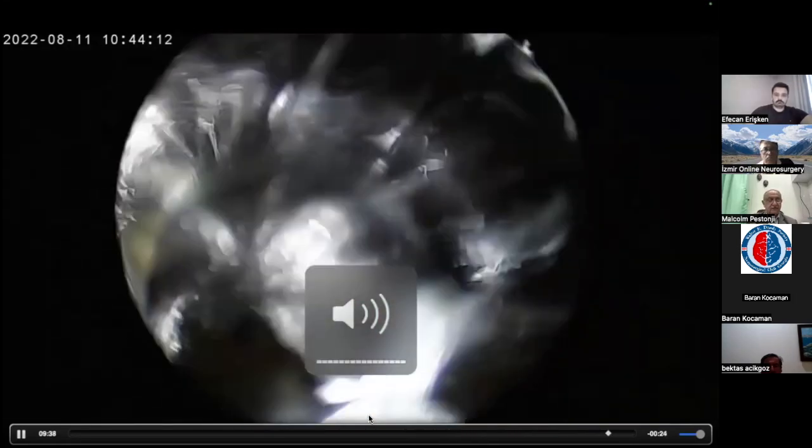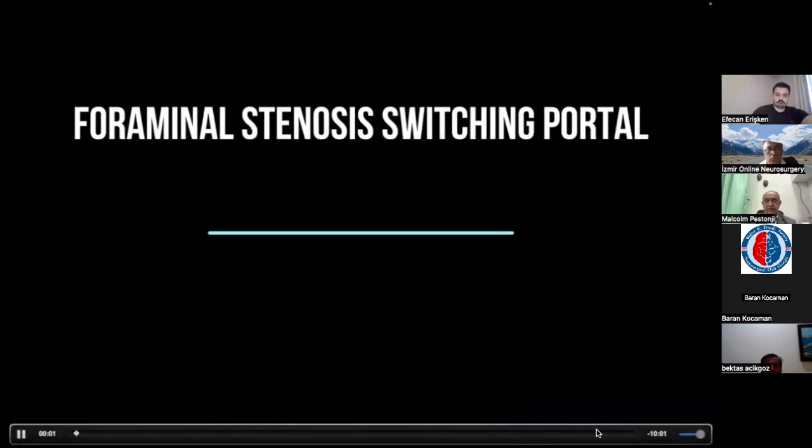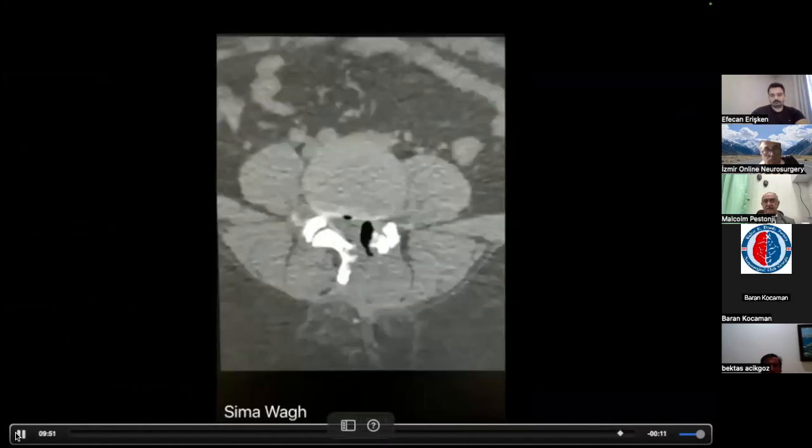We have done a CT scan. Right, as I've done, see the adequate resection of this. Can you see that I've cut the SAP adequately here? This is an immediate post-operative CT scan of the patient, within minutes of the surgery. And the SAP is retained more than 50%. You can even see the air bubble inside that is still retained, some air over there.